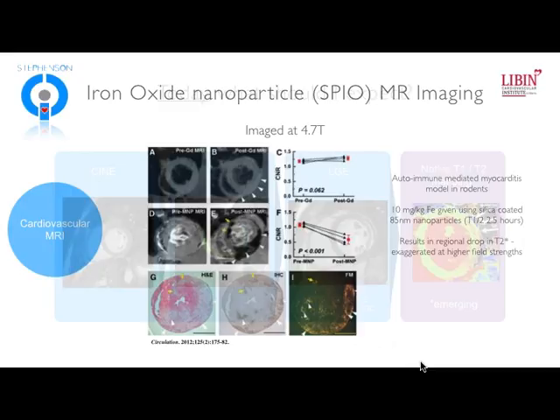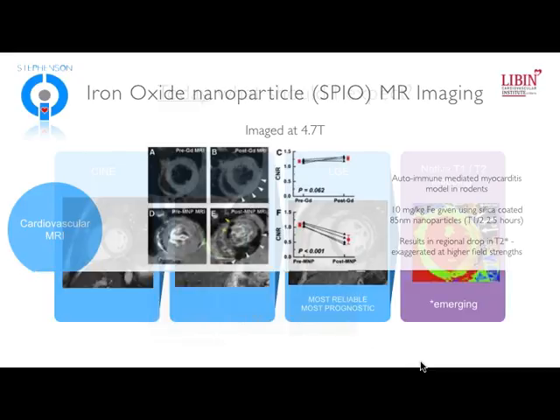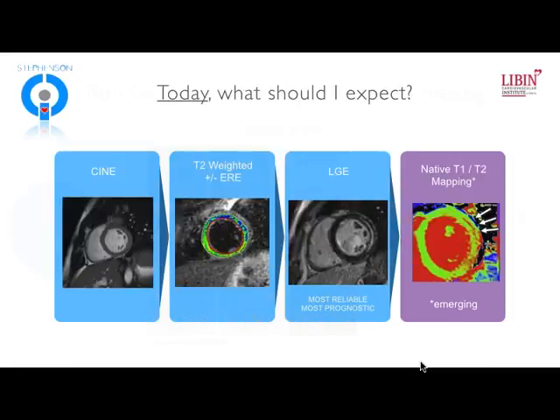Now, there are actually clinically available agents that we can use to do this, which have been used for iron replacement therapy in the setting of renal failure. And so these are FDA approved for that indication in patients with renal failure. And so the potential exists to now take this work into human study in the setting of acute myocarditis. So, but what should we expect today from cardiac MRI?